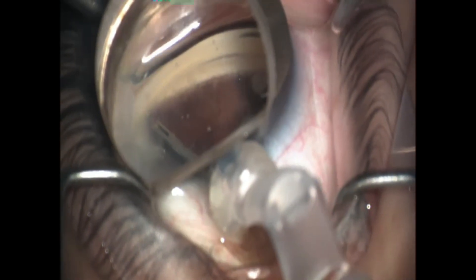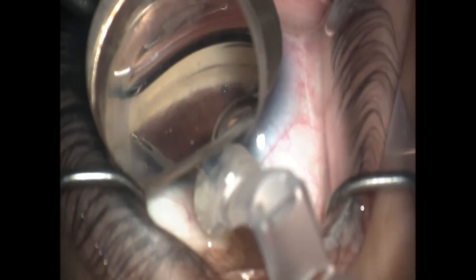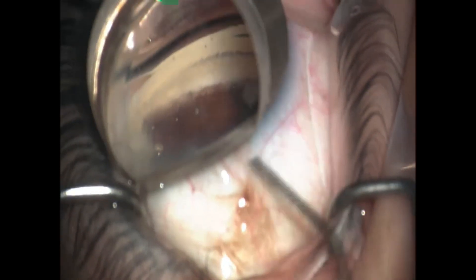Once I get to where I think I have a good spot, I inject — it looks good from here. Looks like I don't like this injection either, so I'm actually re-picking up this stent. I use the tip of the trocar to push it in that last little bit, and now I'm bringing in the viscoelastic injector. I'm going to clear the area again and just make sure that stent is completely lodged in place and stable — which it is now.